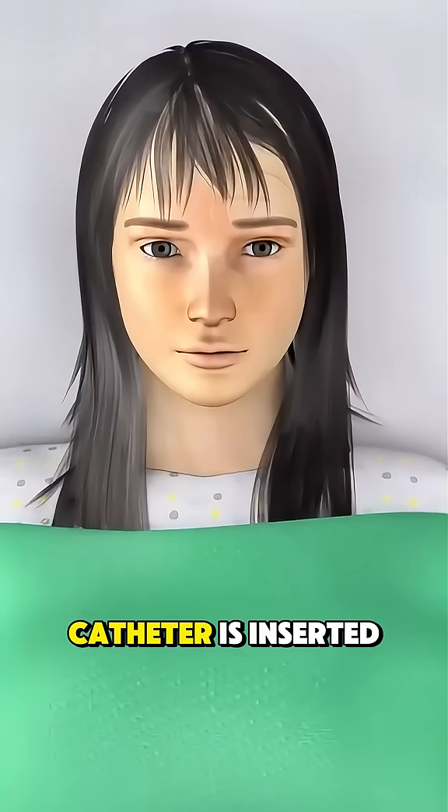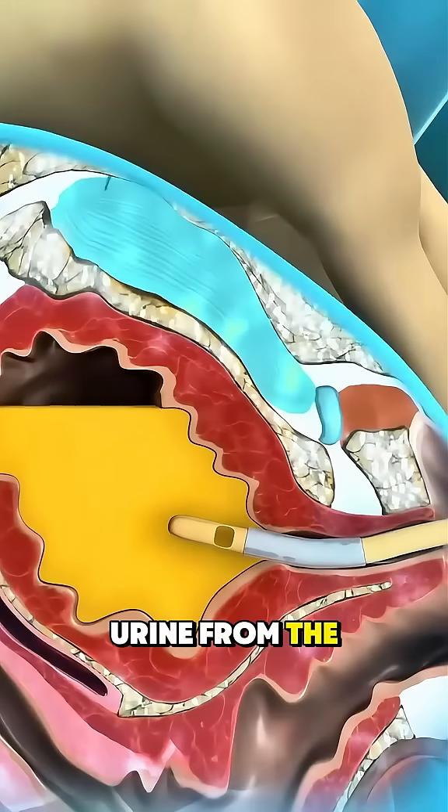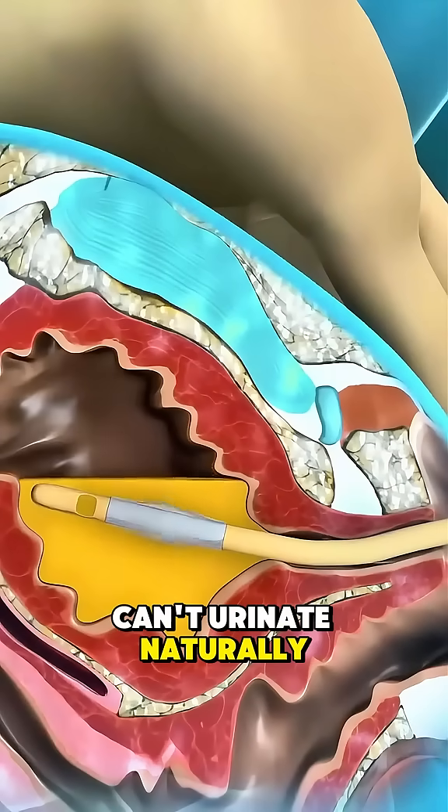Ever wondered how a female Foley catheter is inserted? It's a sterile procedure done to drain urine from the bladder when a patient can't urinate naturally.